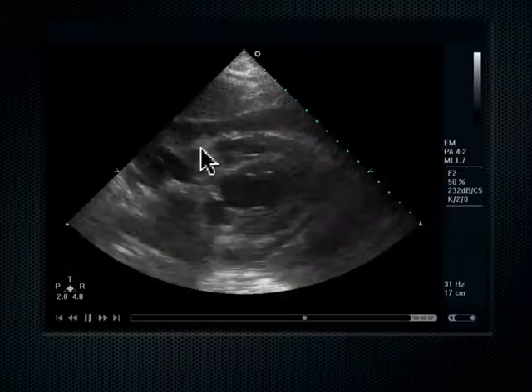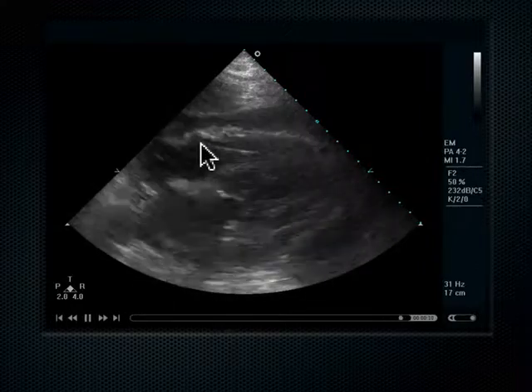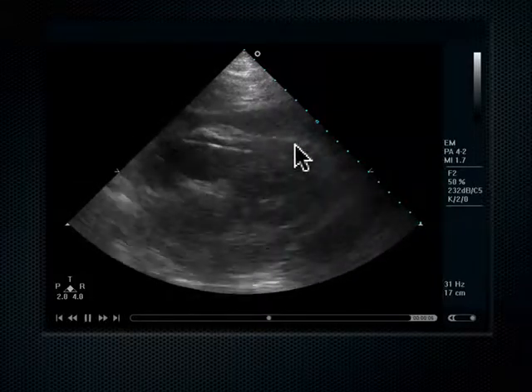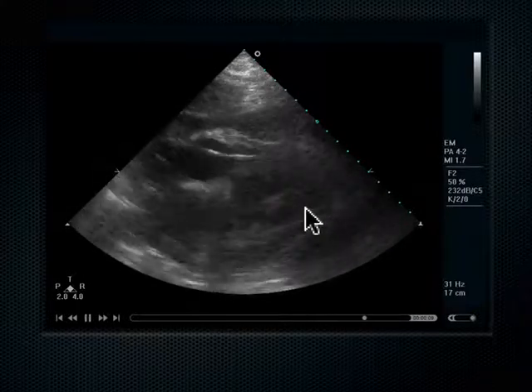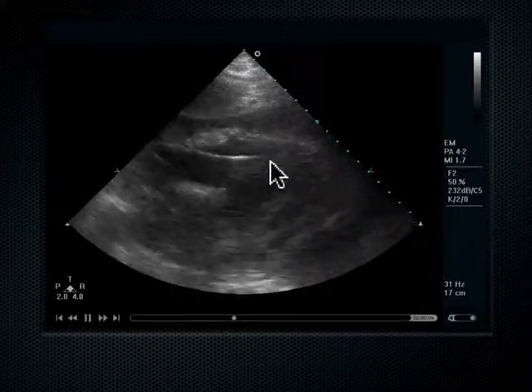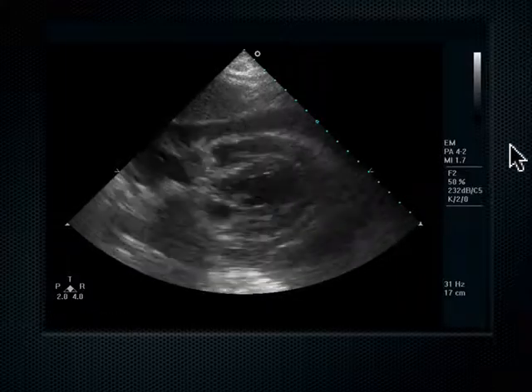Well, on ultrasound, you can see the guide wires coming into the RV. Not only can you help guide the guide wire in, under this is a subxiphoid view, because that's the liver. Not only can you guide the guide wire, but you can also see when the electrical activity becomes mechanical capture as well. And so you can see all of a sudden when you get in the right spot and when you start to see the heart become mechanically captured. I wish I had the earlier part of this clip where the guide wire was coming in and then all of a sudden it started to capture, but nobody recorded that part of it.